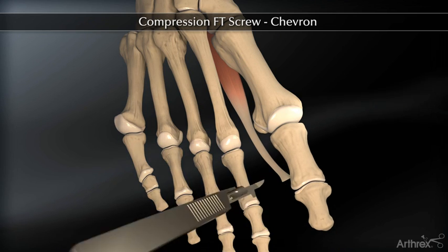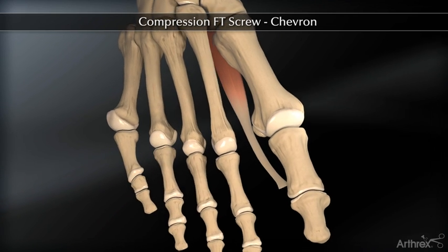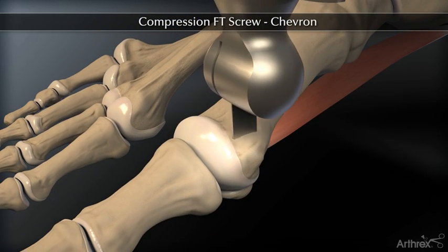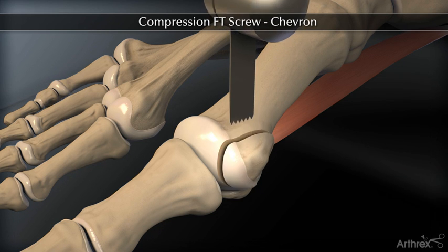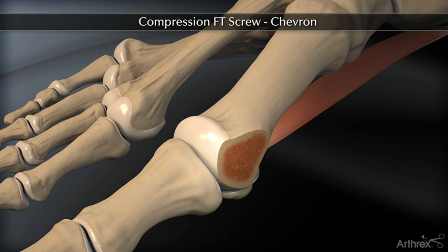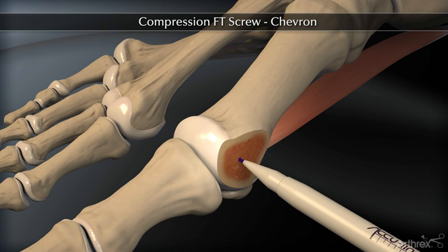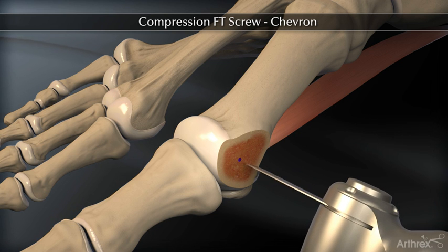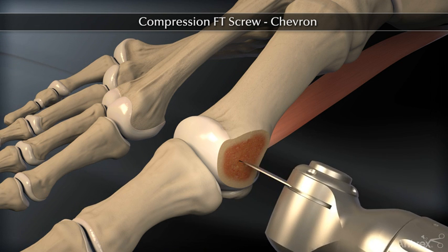First, release the adductor hallucis. Next, mark the center of the metatarsal head with a marking pen and draw the osteotomy on the bone for accurate and precise cuts. Use a sagittal saw and perform the osteotomy.